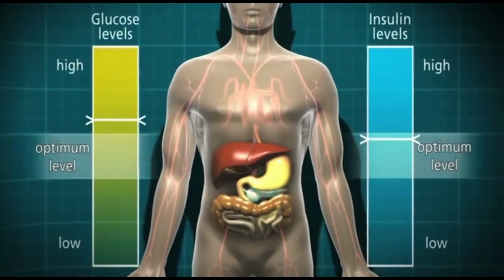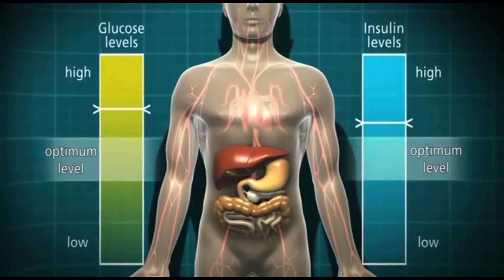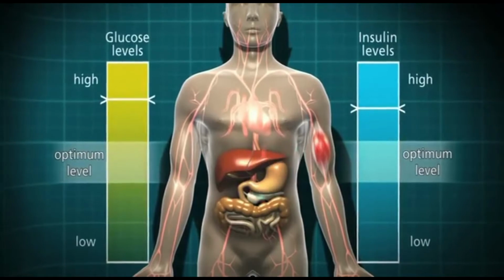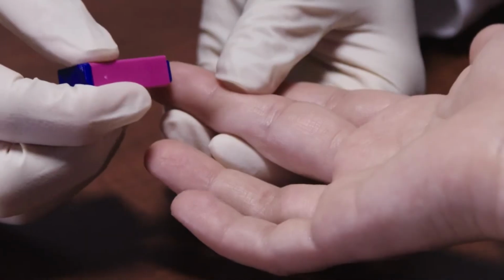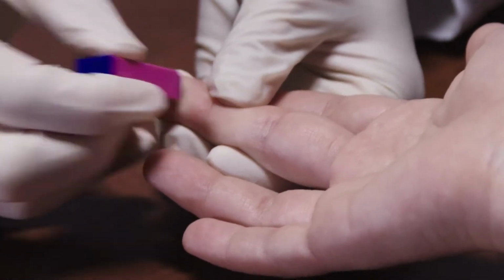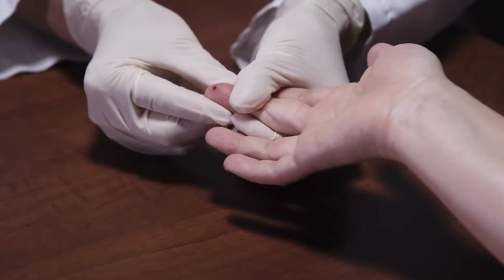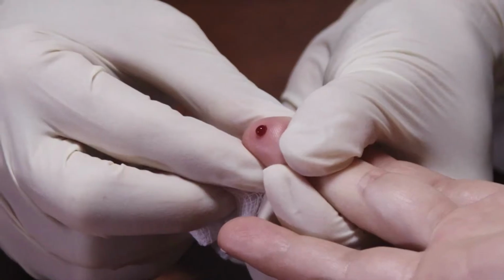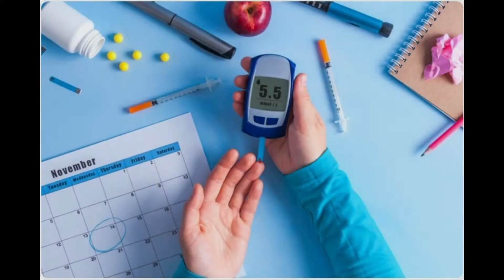As we know, diabetes is a common life-threatening disease among people around the world, which occurs when the glucose concentration in blood becomes extremely high. But the common method used for the measurement of blood glucose is the invasive one, which involves finger pricking. The invasive technique can cause discomfort, and the test strips and syringes are costlier. So with the development in technology, non-invasive blood glucose monitoring will become more efficient, affordable and extremely competitive in the market.